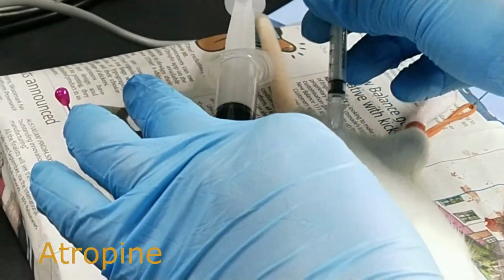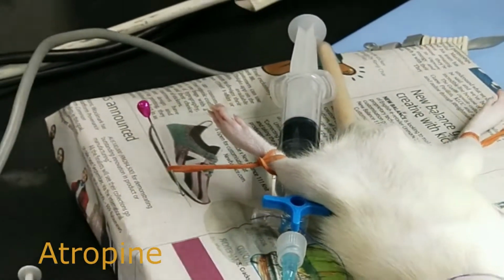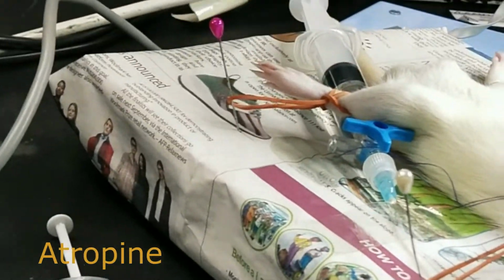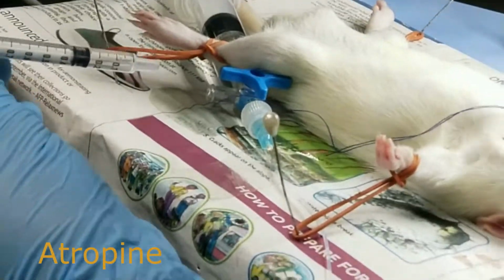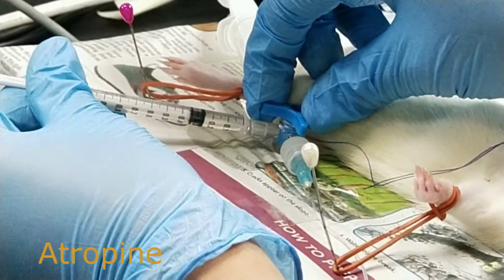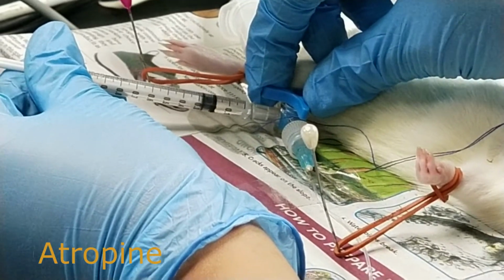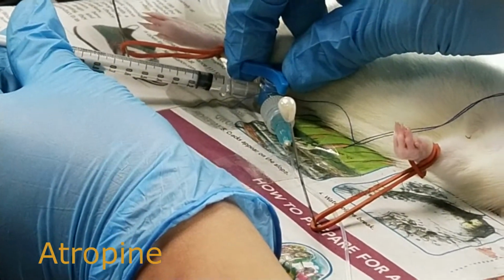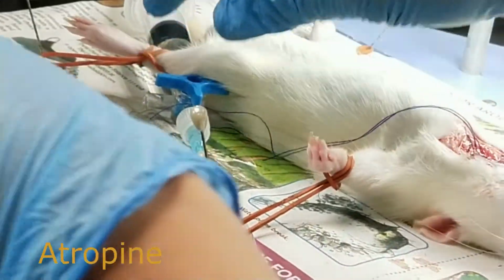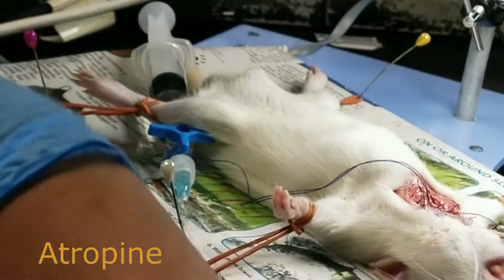After that, we're going to proceed with the injection of 0.25 ml of atropine through the IV, and then followed by 0.5 ml of normal saline for the flushing.